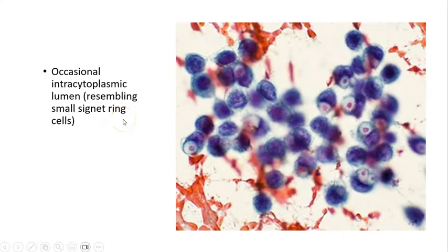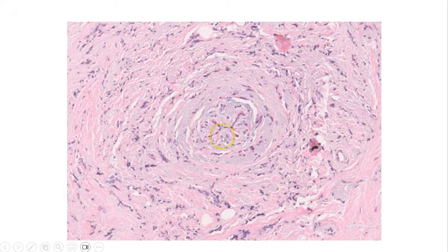Sometimes in lobular carcinoma, we can also see intracytoplasmic lumina, such as this, within individual cells. And these are cells of invasive lobular carcinoma metastatic to a body fluid sample. This is a cytology smear, and this is a Papanicolaou stained smear. And this picture is just to recap the concentric arrangement of malignant cells around benign ducts.